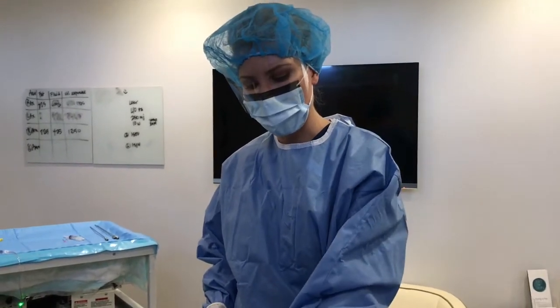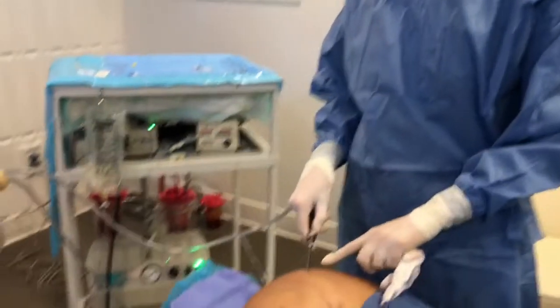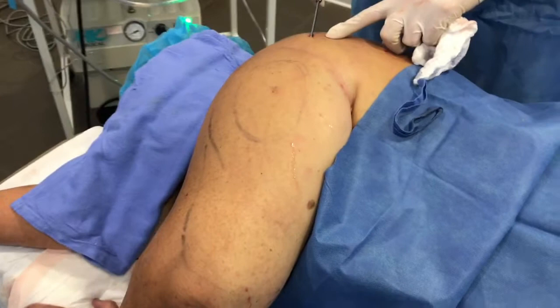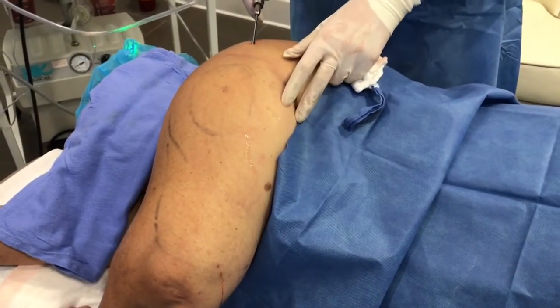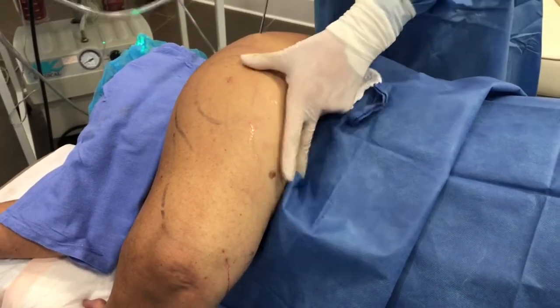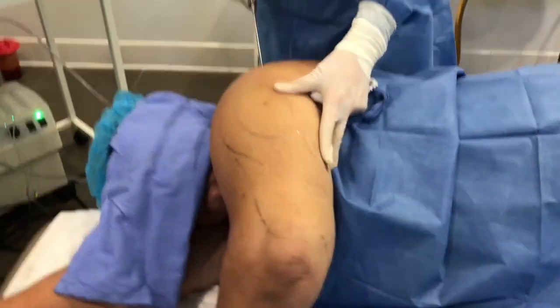But what we're actually going to treat now is the arm. I've indicated areas that we want to concentrate topographically on the arm. I've inserted our actual cannula that we use to remove the fat, and this is going to hide so well — the little entry point will just disappear over time. I'm just starting to remove the fat in this area, and we start with deeper layers and then work up more superficially.